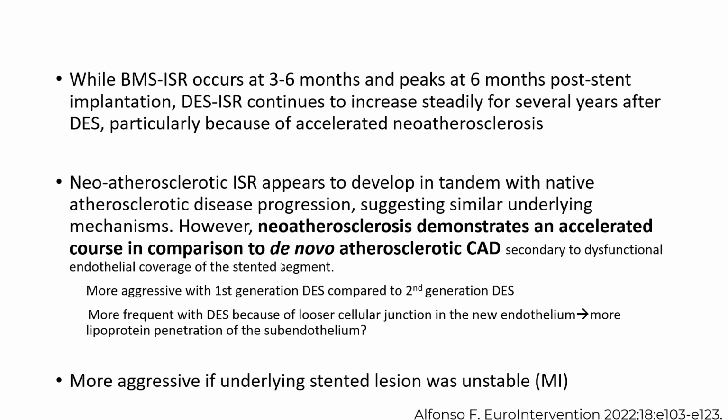And this is kind of the hazard of DES used for moderate disease, those 50%, 60% lesions, even if it is hemodynamically significant disease, because you might convert a native atherosclerosis into something that is more aggressive over the long term. So be careful. I like to stent critical disease. That's one of the reasons.